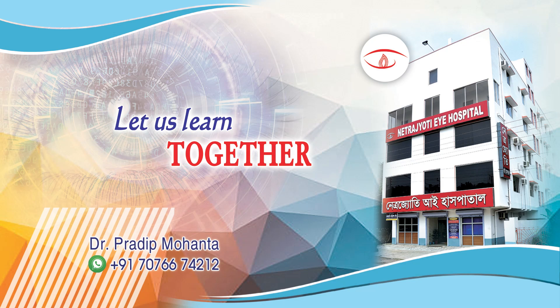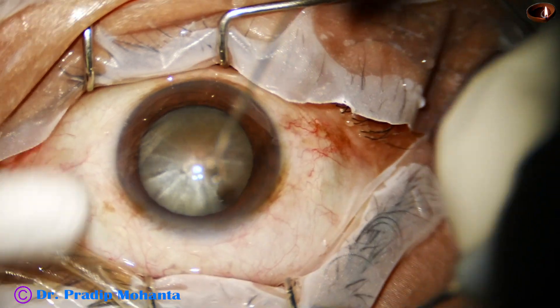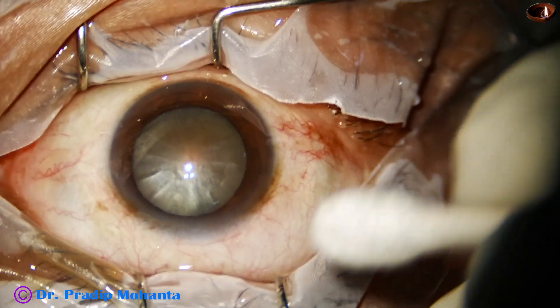Friends, welcome to my workplace at Ranakh Heart, West Bengal, India. This is a hard cataract. Let us see the management of this case.